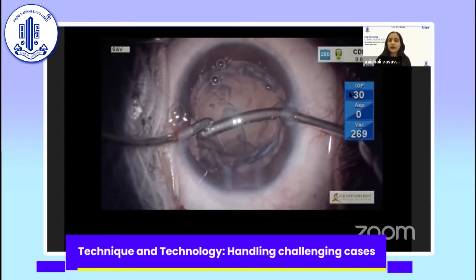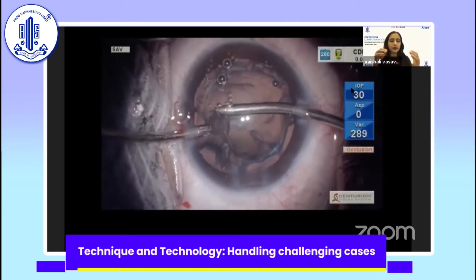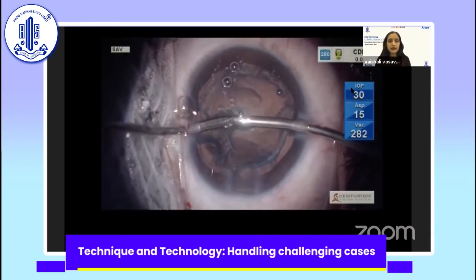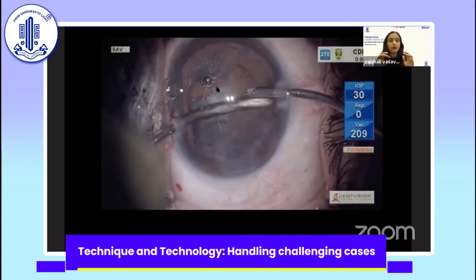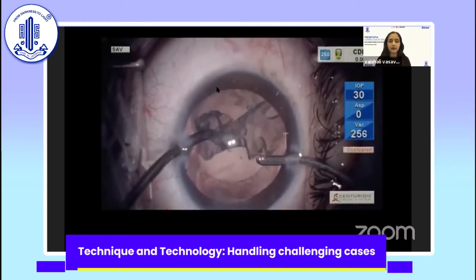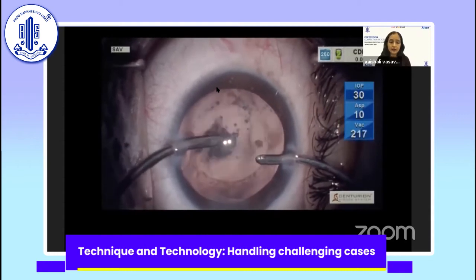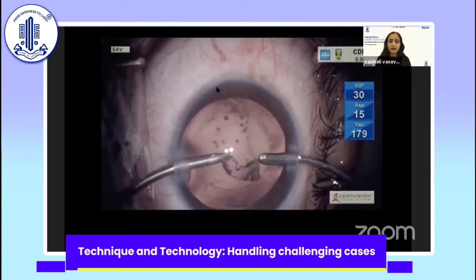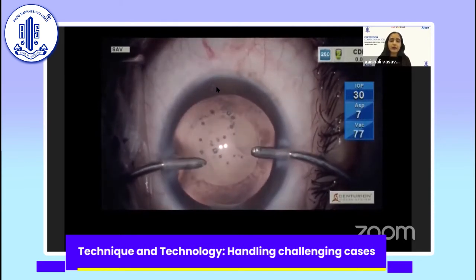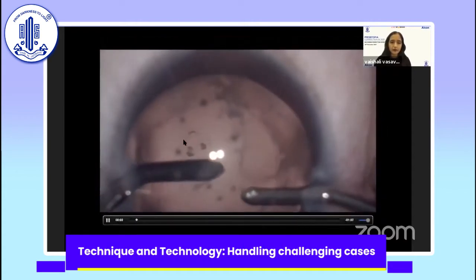So now again, notice that the bottle height or the IOP is very low. That means you don't want too much inflation. These capsules are inherently weak, and let's say there is a small defect which you may not be able to notice at this point. You don't want too much infusion pressure hydrating the vitreous. And we can see here that using the good technology and skill, obviously, which cannot be undermined, the entire capsular bag is empty. And as is typically the case with a lot of these young patients, the posterior capsule will typically have some deposits or some plaque, as you can see here.